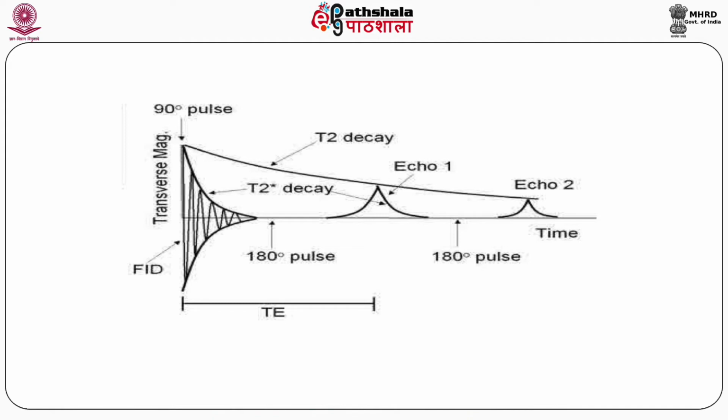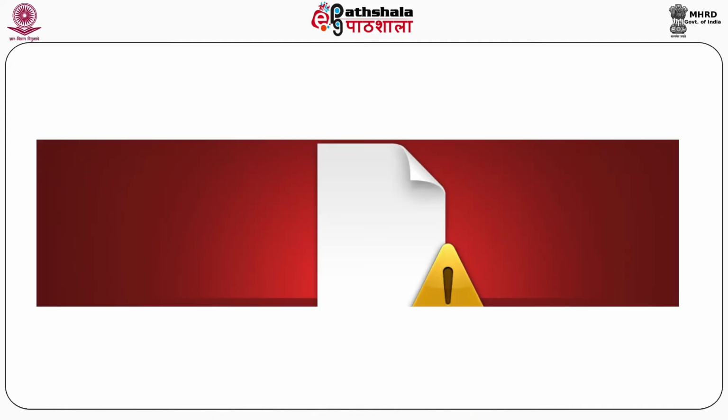And you can see now, after T1 and T2, what is free induction decay, FID. The primary MR signal is called free induction decay. It is very fast and cannot be measured easily. The signal is at maximum strength immediately following excitation and decays to zero by relaxation processes. The decay of FID is due to loss of phase coherence of individual spins over time.